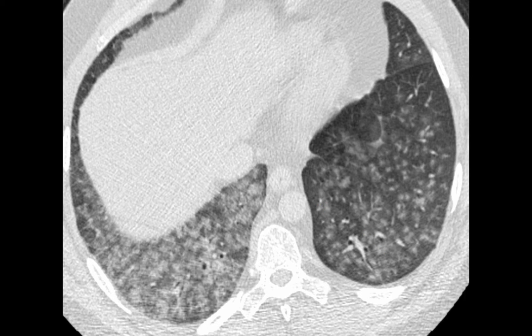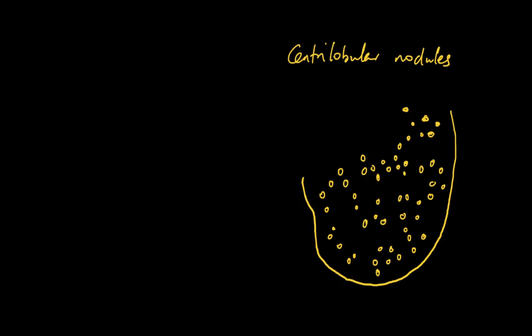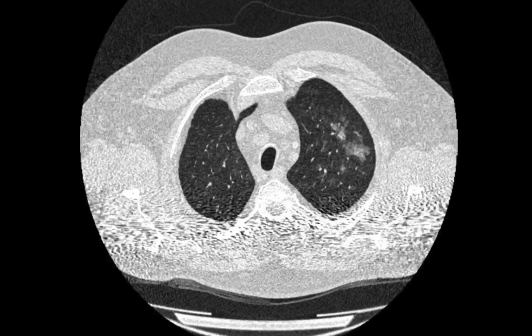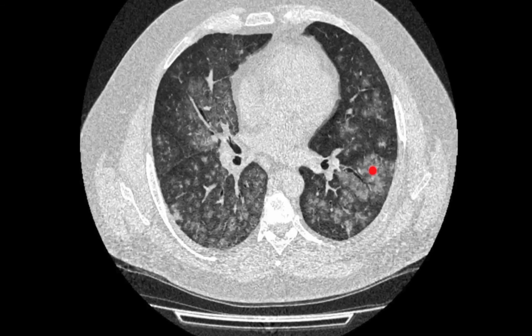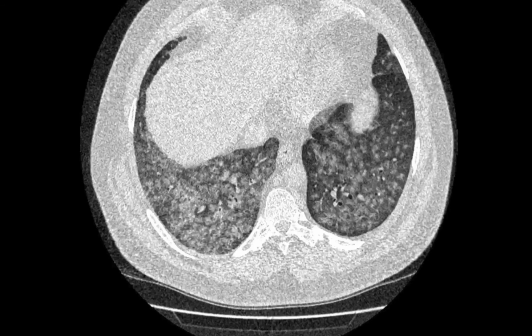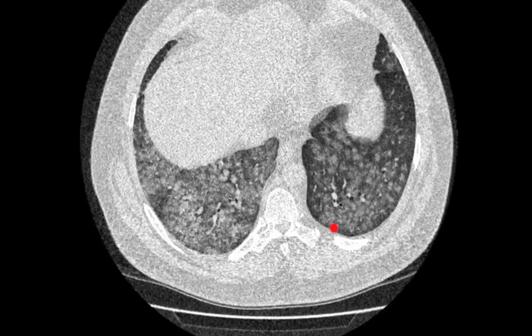As these nodules start coalescing they form more of a ground glass change. This demonstrates the central lobular nodules. This is the same patient, just illustrating the distribution of nodules throughout the central lobular portions of both lungs. You can see that in the periphery of the left lower lobe there is a gap between the central lobular nodules and the pleural surface, indicating that each of these nodules starts in the centre of the secondary pulmonary lobule.